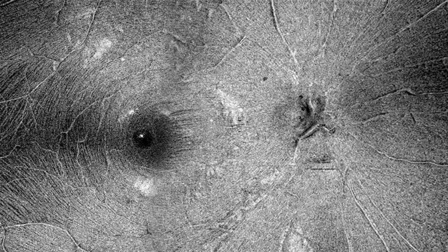This also becomes interesting potentially. This needs to be proven in systemic diseases. We know that in multiple sclerosis, the RNFL will actually get thinner. But the question is, what gets thinner? Is it the ganglion cells? Is it the nerve fibers? Up till now we don't know, but now we have a way of visualizing the nerve fibers, and so now we can start thinking about these kind of things in a much better way.